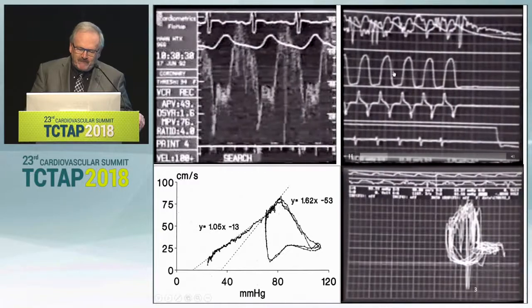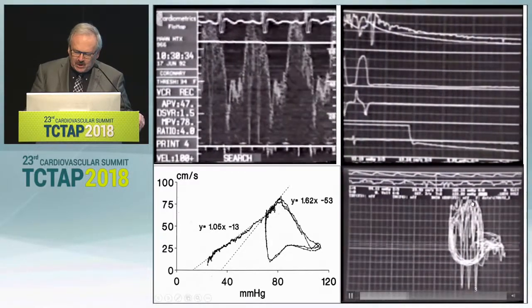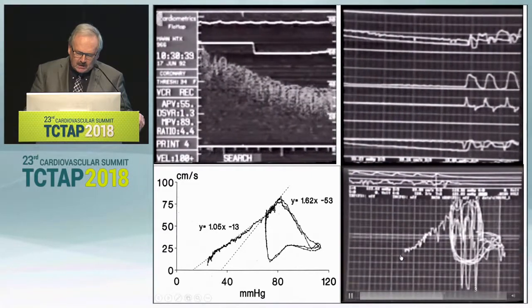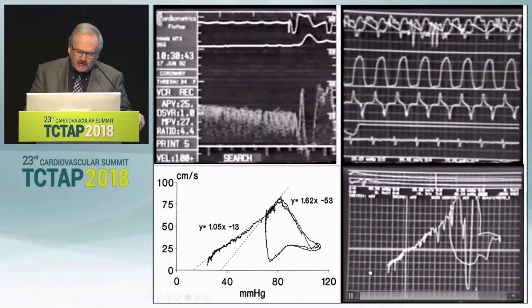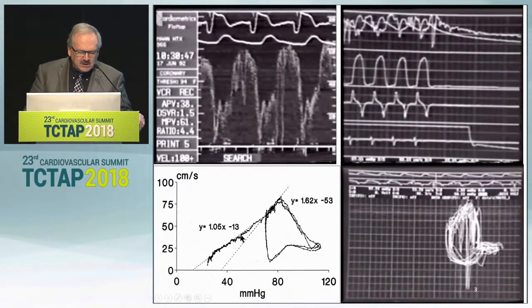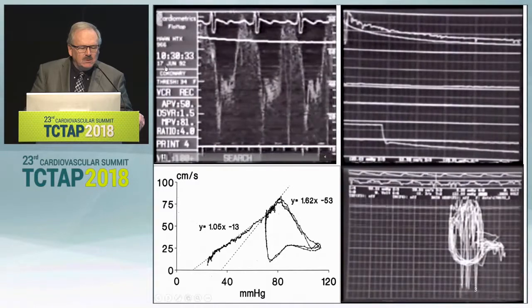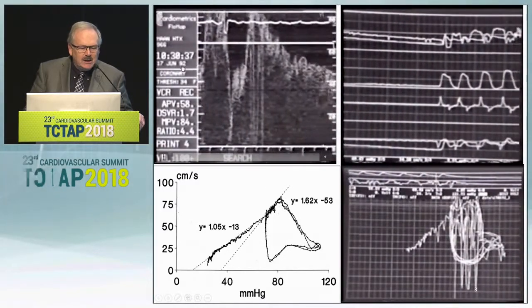We had also the left ventricular pressure and the dP/dt. And you see here the pressure velocity curve and the moment where we stopped the heart, and we could get in one beat the pressure velocity relationship during maximal hyperemia. This is what you see here. Mind that the date of this work in human was June 17, 92.